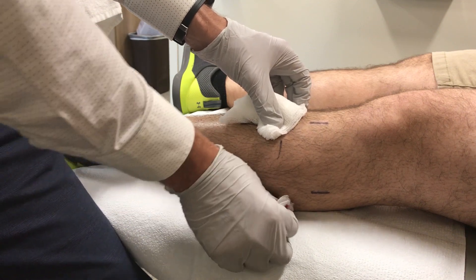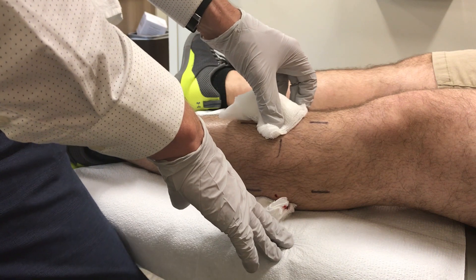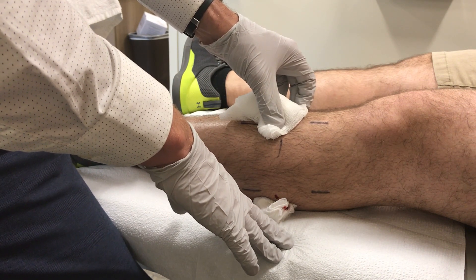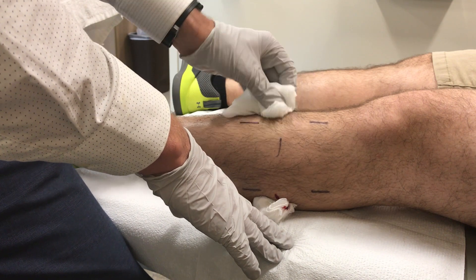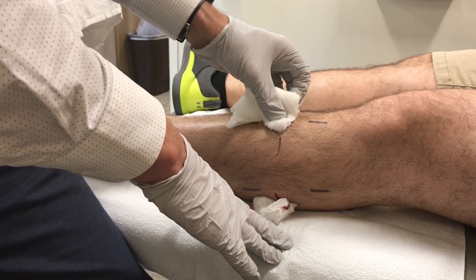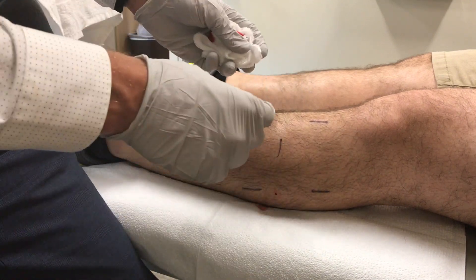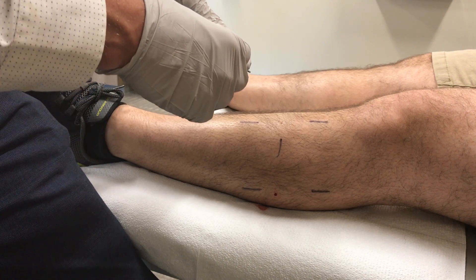Diagnostic thresholds are: pre-exercise 15 mmHg or higher is positive; one minute after exercise 30 mmHg or higher; and five minutes after exercise 20 mmHg or higher. The anterior compartment is usually the most common area involved. Chris was borderline on his anterior compartment, and that's the end of this demonstration.